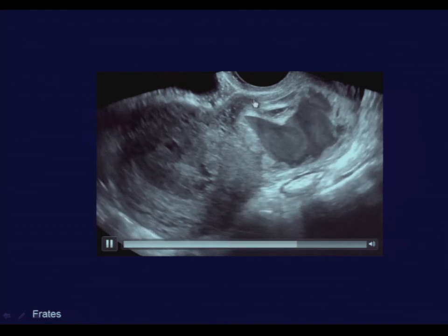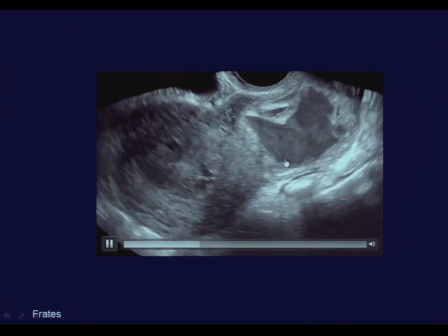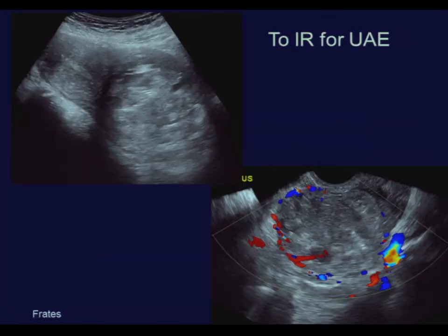So this was either an AV malformation or just a large area of retained products with a saccular aneurysm created with the retained products / accreta. Patient went to interventional radiology for bilateral uterine artery embolization, and following that procedure had an enormous hematoma here set at the level of the cesarean section scar. And you can see the hematoma here transversely, a little bit of flow to one area of it, presumably this piece, with a little bit of still viable tissue here.